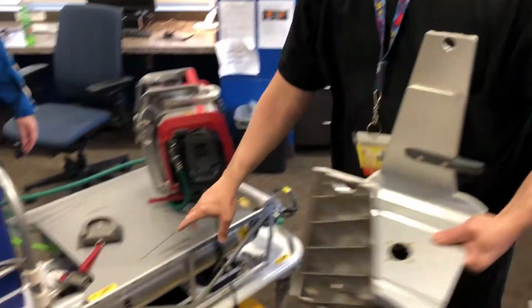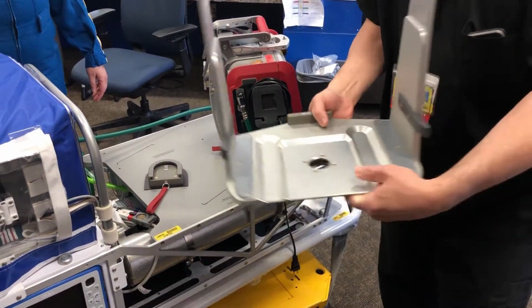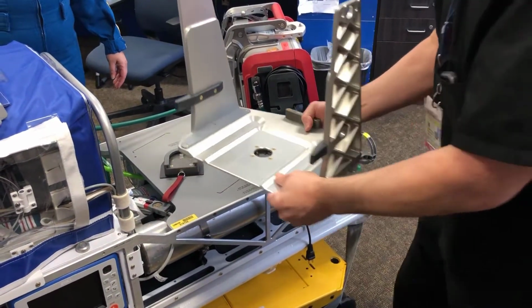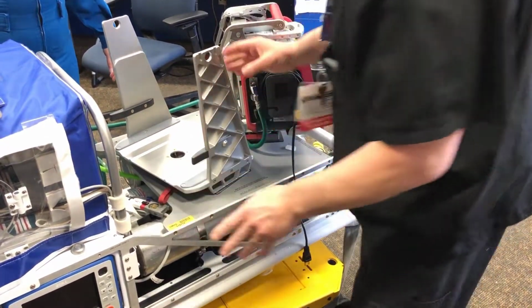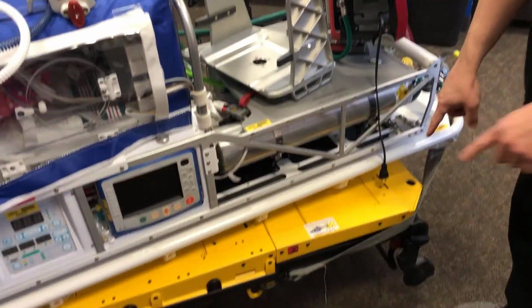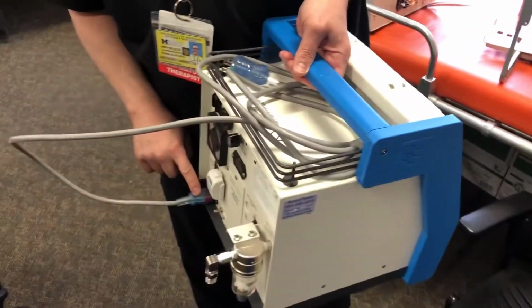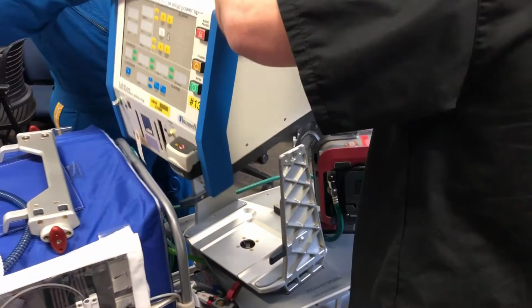We will arrive with our jet ventilator bracket, and again, there are lines that show you how this is to be configured. So it'll go this way because the face of the jet ventilator is going to be facing this way. So you'll insert it into the mount. It snaps in. Make sure you're locked. Okay? You're going to want to lower the sled as low as it goes, because now you'll take the jet ventilator. You can leave the plug in or you can remove the plug if you want, if it's easier. And it should just lift up.